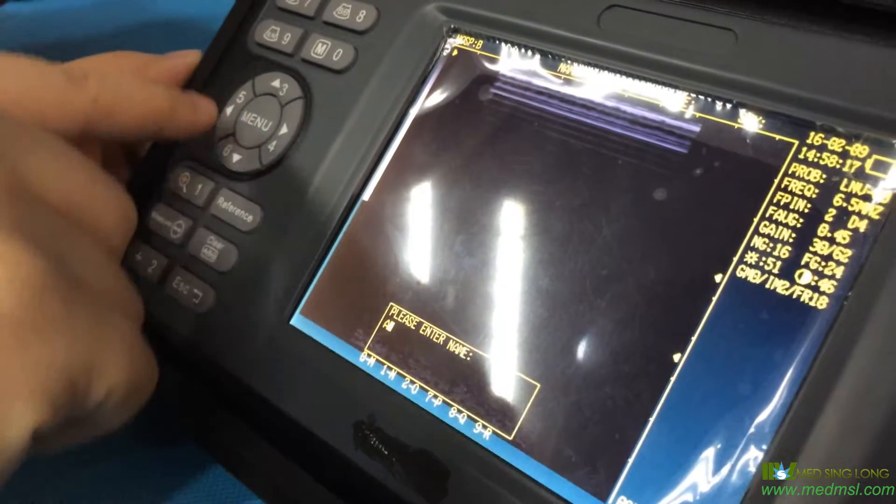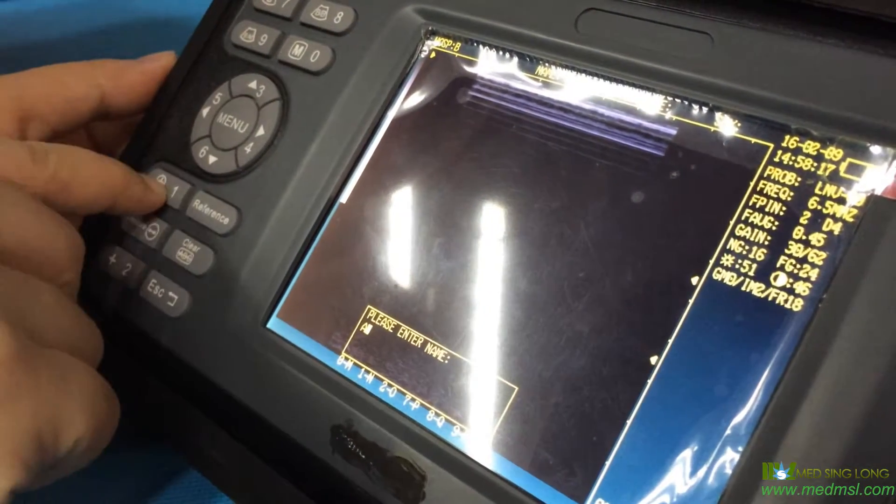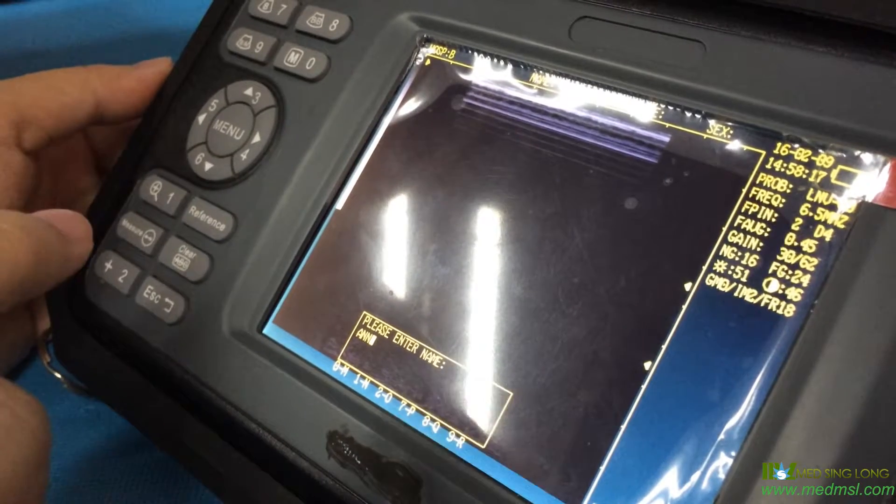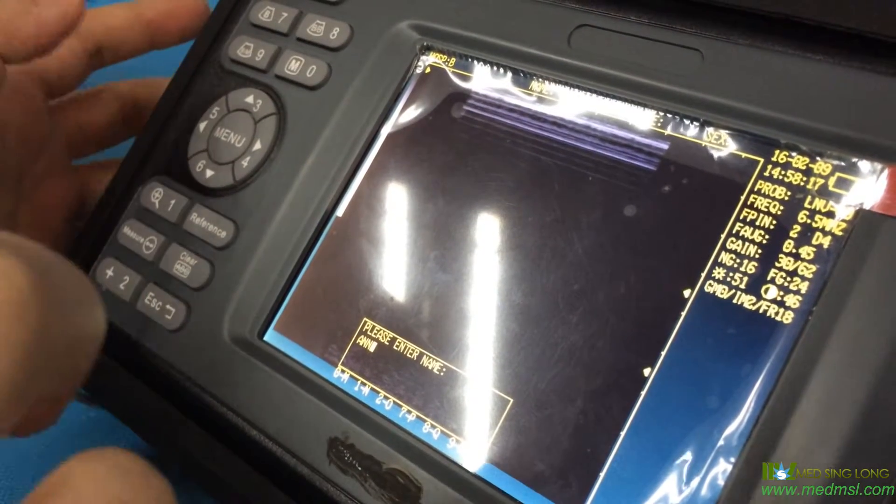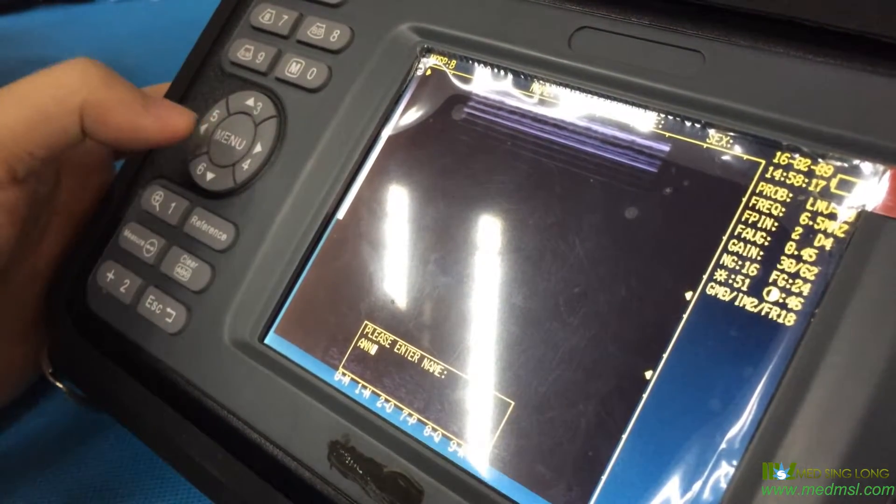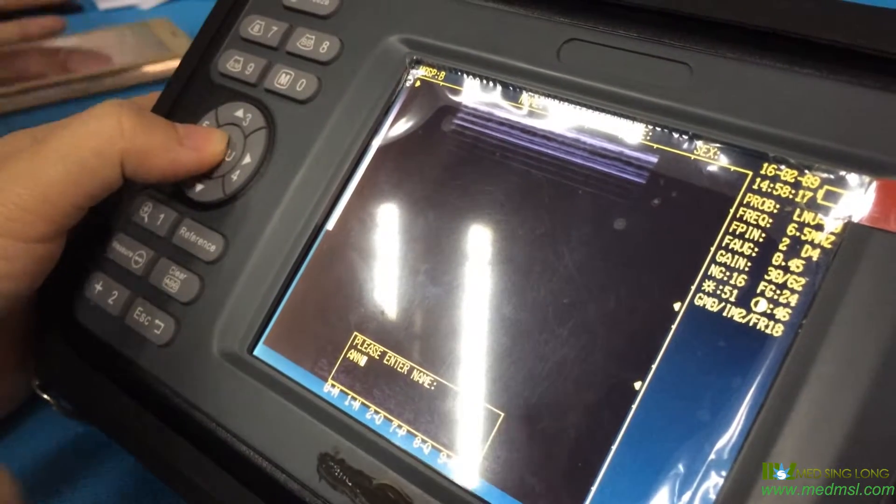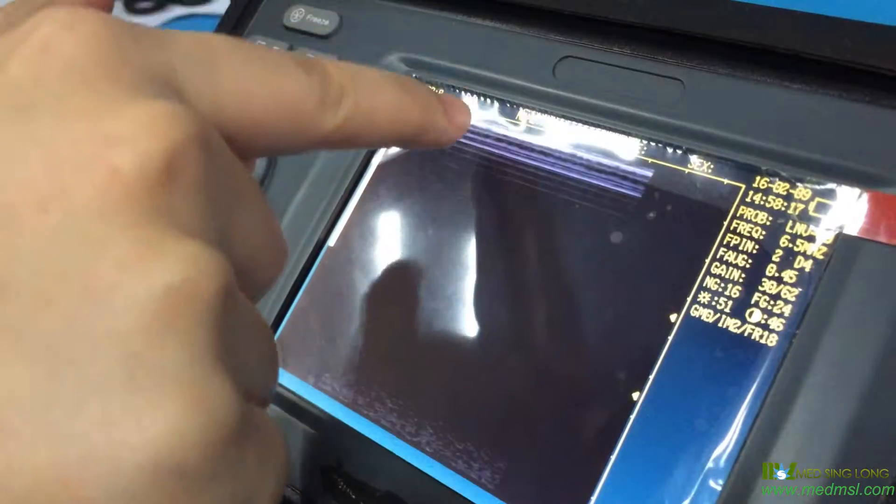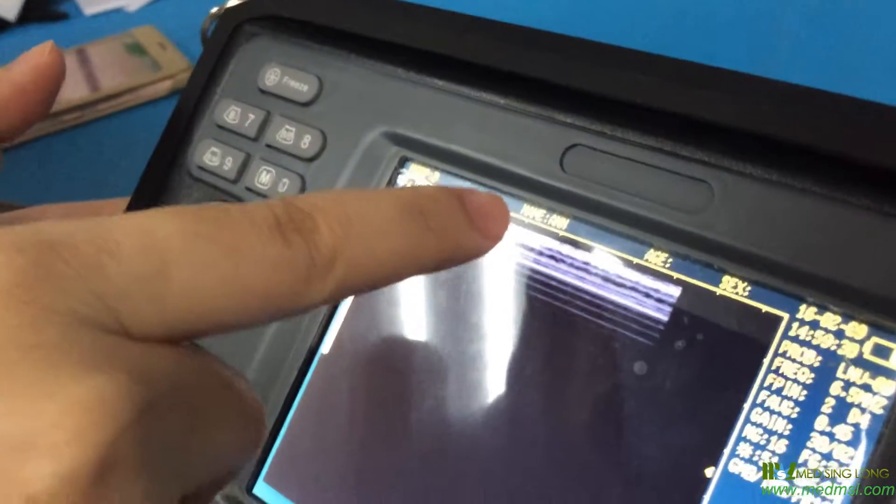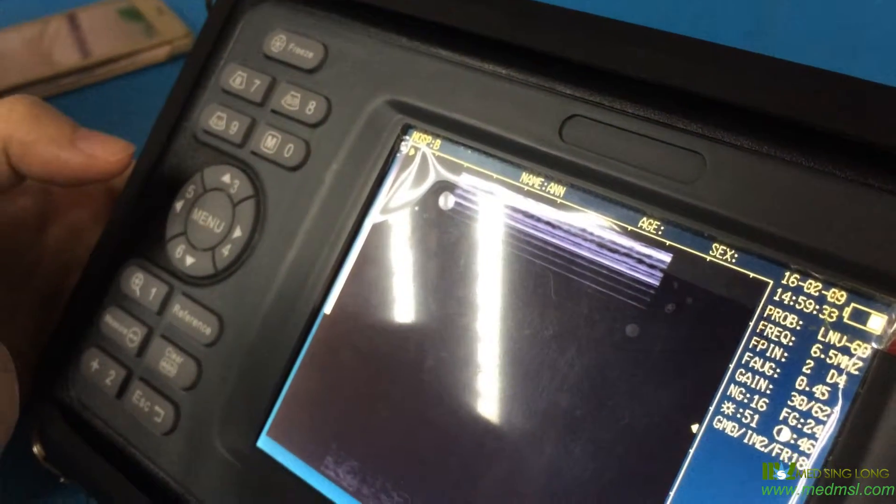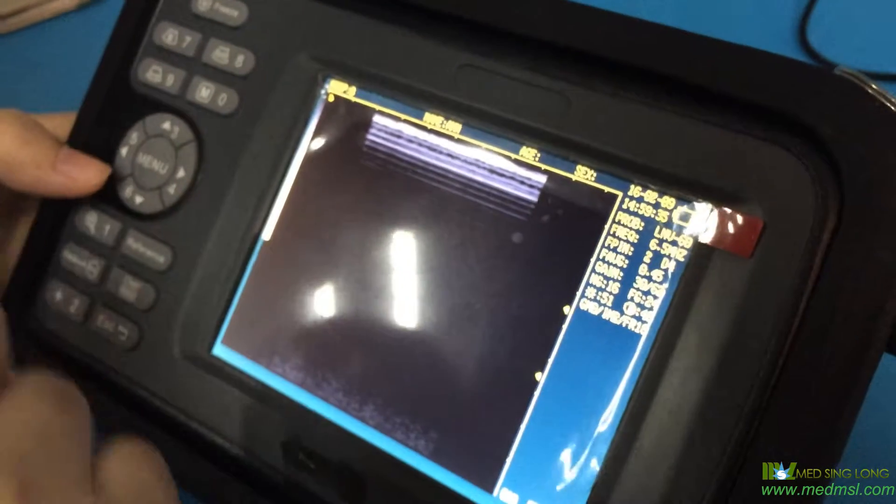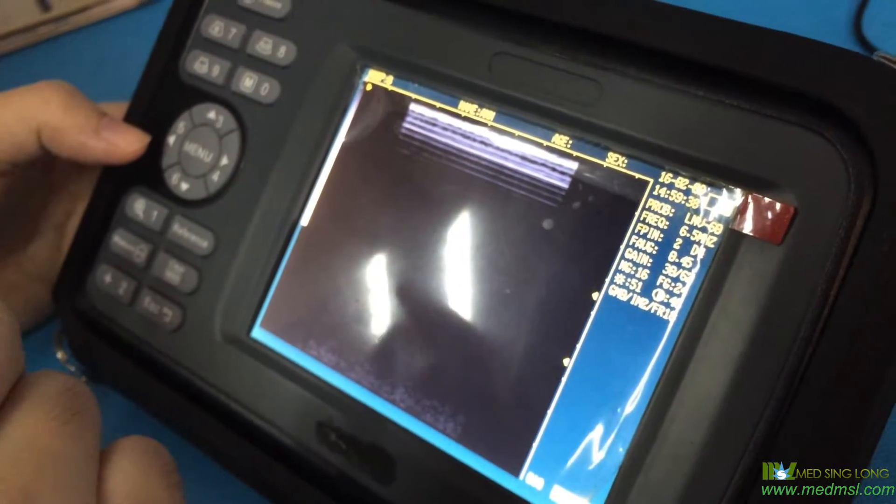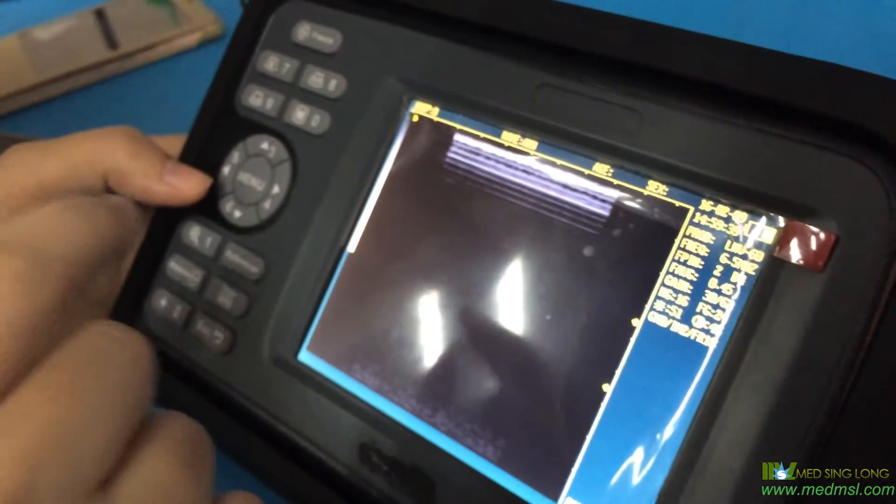One is N. Now we finish entering the name and then push the menu button to save it. You can see the name is now saved as ANN. If you want to write down the age of the animal, you need to access the menu again.